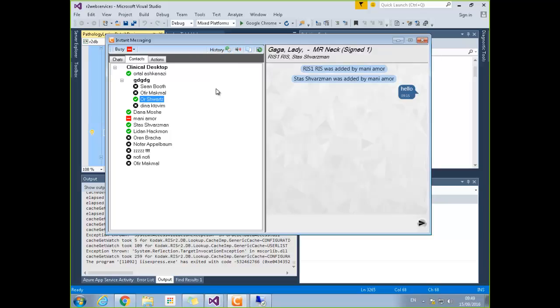In terms of infrastructure, these messages, are they stored in the database? Yes. All of them? Yes. Is there a cleanup planned or something? That's also in the future list, message cleanup. I don't think that you would be able to delete them because it's an audit. Exactly, and that's what you have to balance. However, after 5 years in Denmark, you can clean everything. He's talking about 14 days.